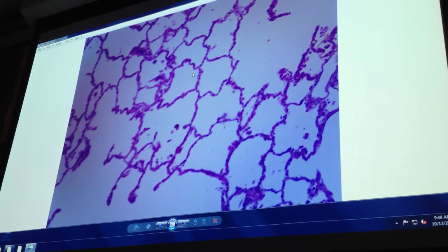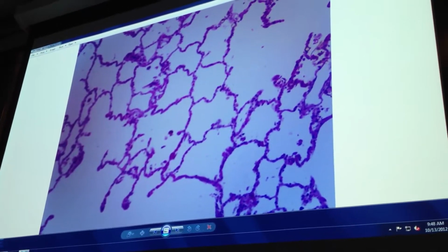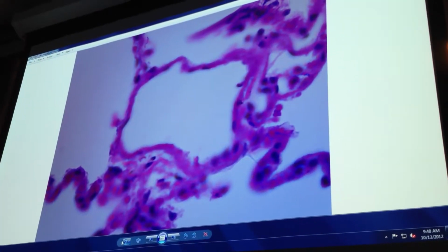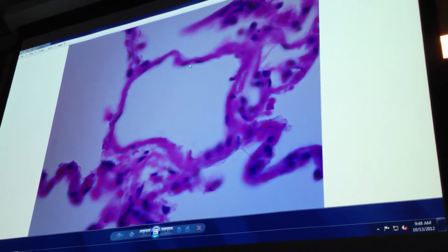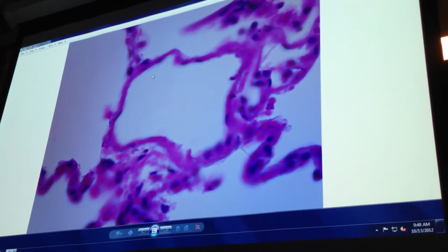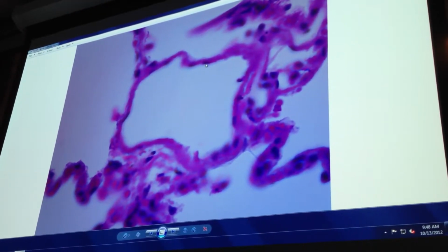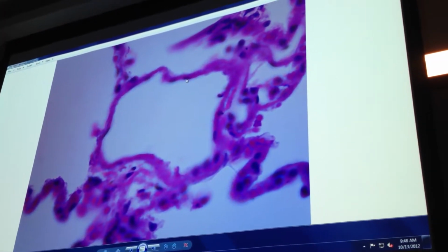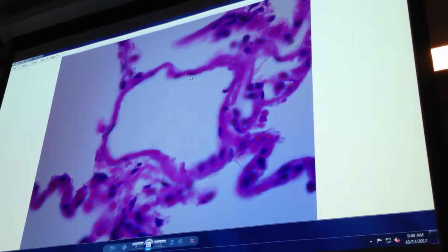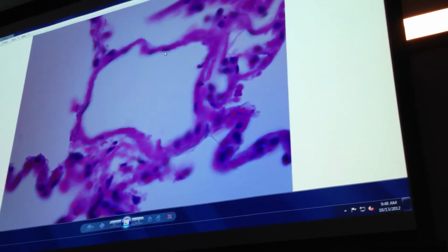Now, what you've got to be careful of here, as I know some of you are sitting there thinking, that could be adipose. Okay? But if you get it on high power, remember that adipocytes are, each one of these are single. These whole things are what? Multicellular. What's the cell type? Squamous. Cell arrangement? Simple. What's the function of simple squamous in this organ? Absorption. Diffusion of gases.